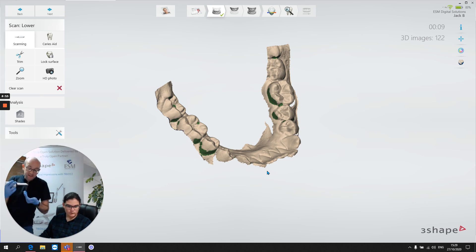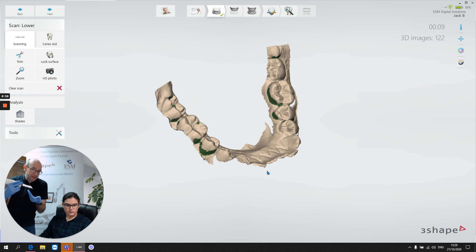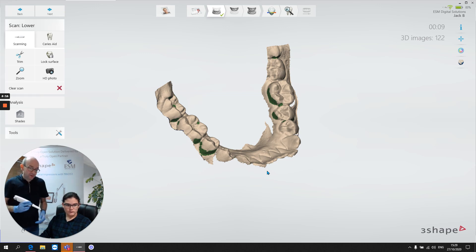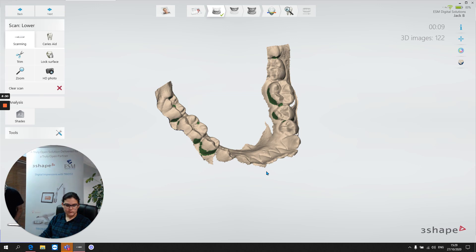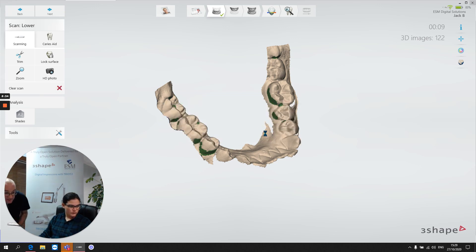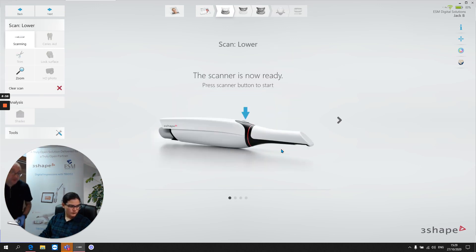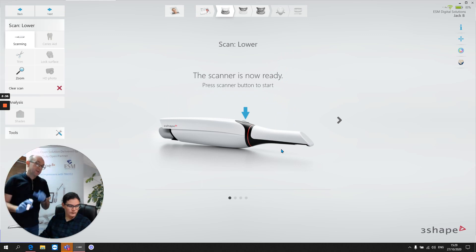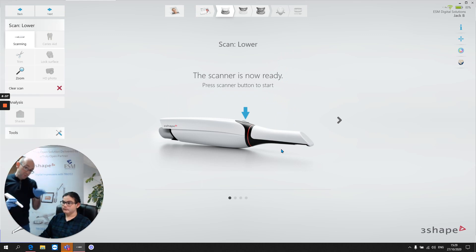If this is the tooth, we hold the scanner maybe a little bit like this. So the scanner is only seeing the lingual surface of those anterior teeth. Good practice here. We could try and rescue that. Let's not. Let's do it the right way.